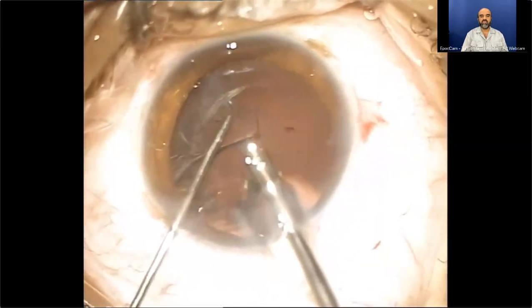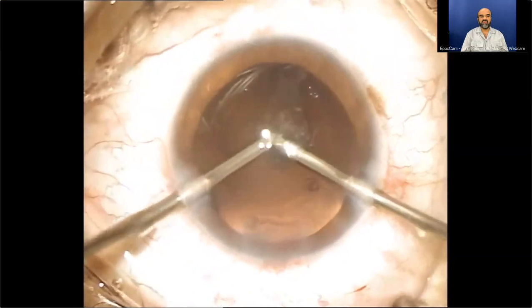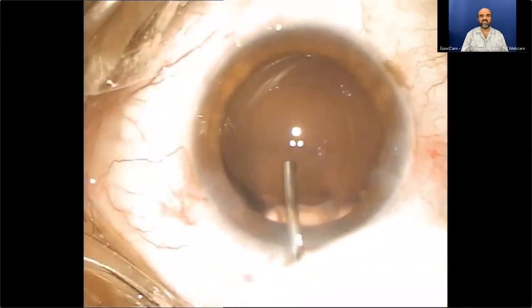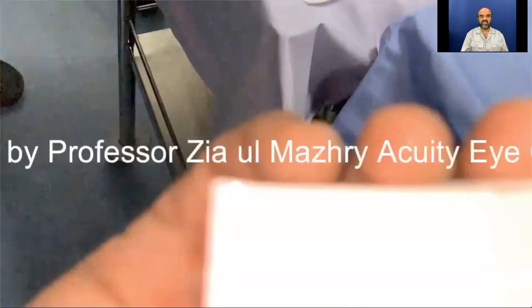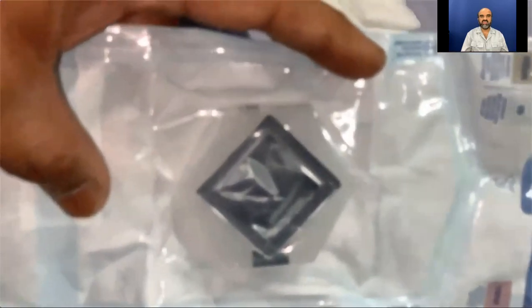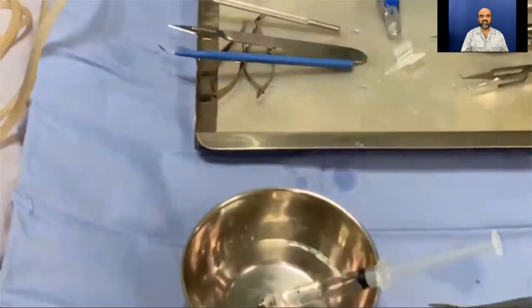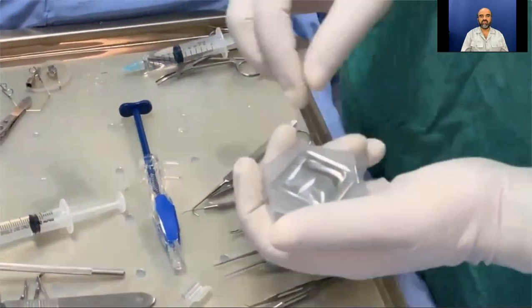I replace the chopper with a fine polishing spatula and complete the phaco emulsification. Then bi-manual irrigation aspiration and polishing of the capsule is performed. The anterior chamber is filled with viscoelastic material. Here comes the ELOF IOL with extended depth of focus — a beautiful lens in our experience which combines quality with economy and gives quite good spectacle independence to most patients.